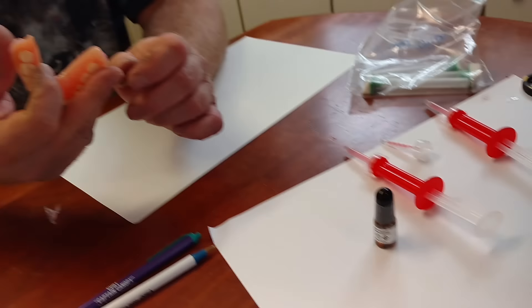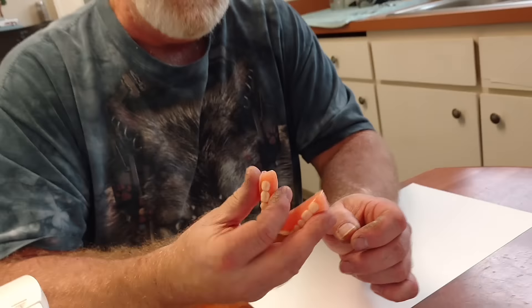They look brand new, they feel new actually. Out of the two sets of dentures I've had, I've never had a pair of dentures feel this good.